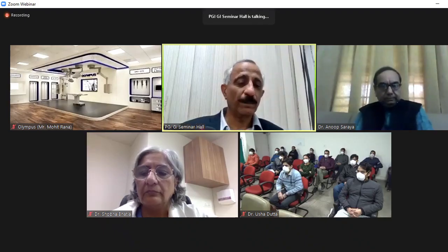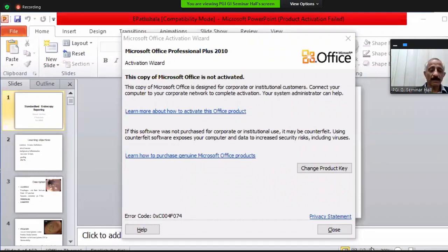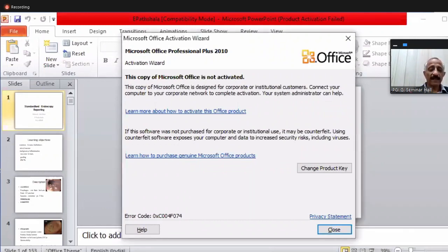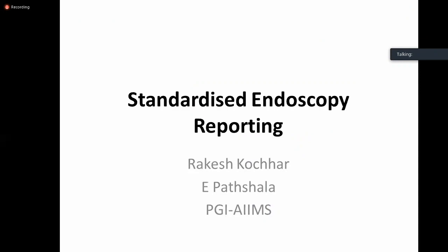Introduce endoscopy for the beginners, how do you report? As Dr. Shobna has said, standardized endoscopy reporting is one which can be understood by anyone across the world.